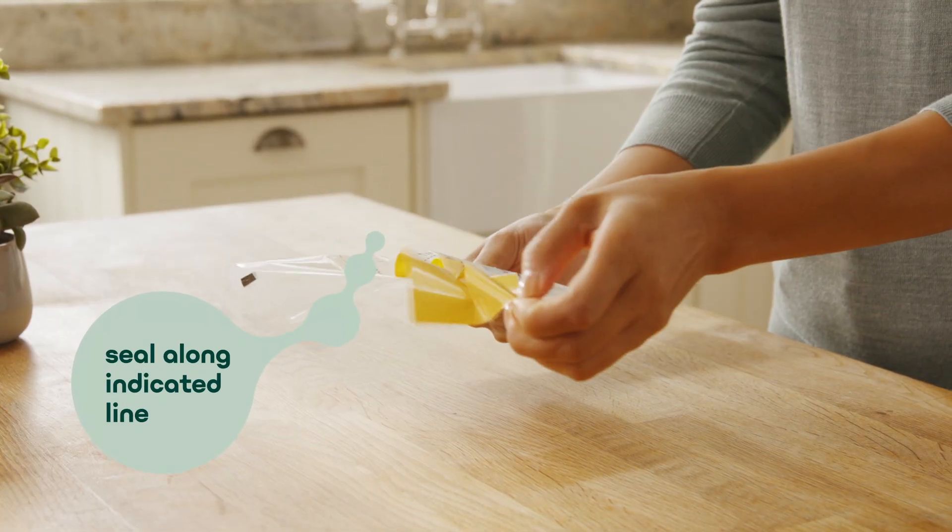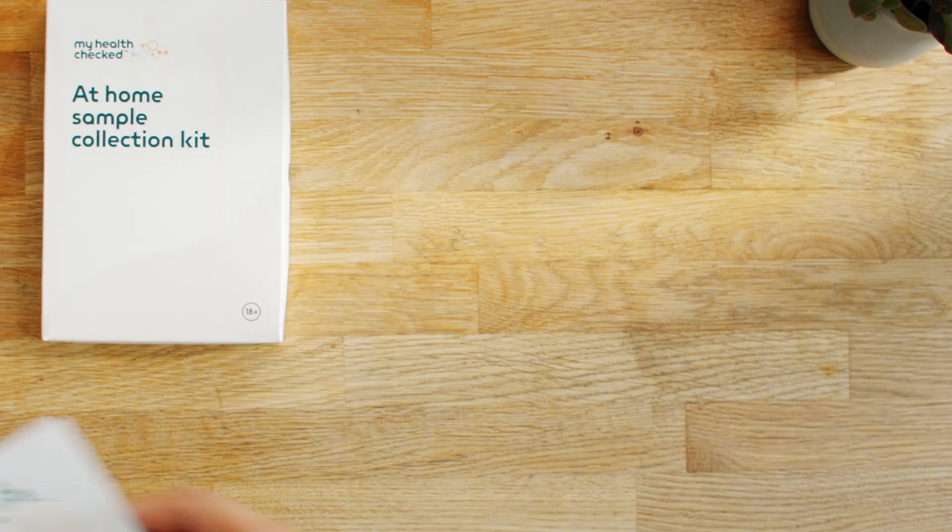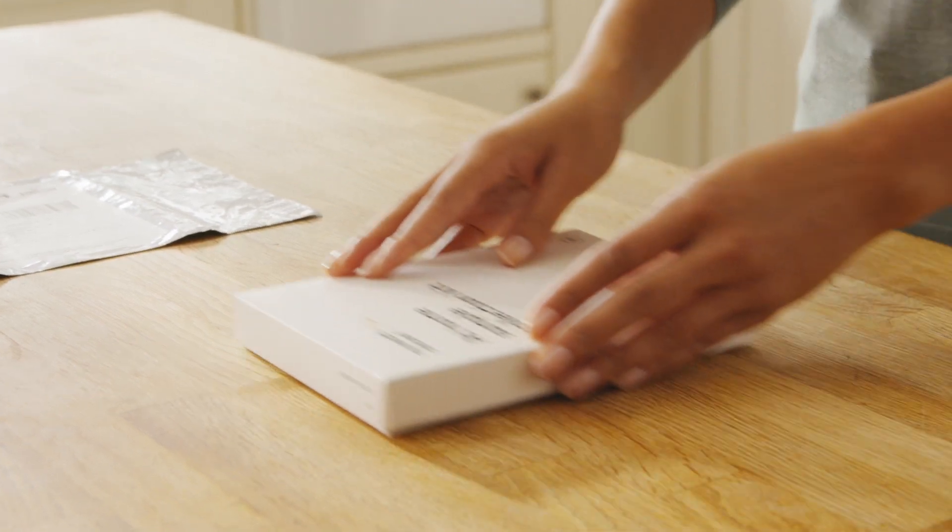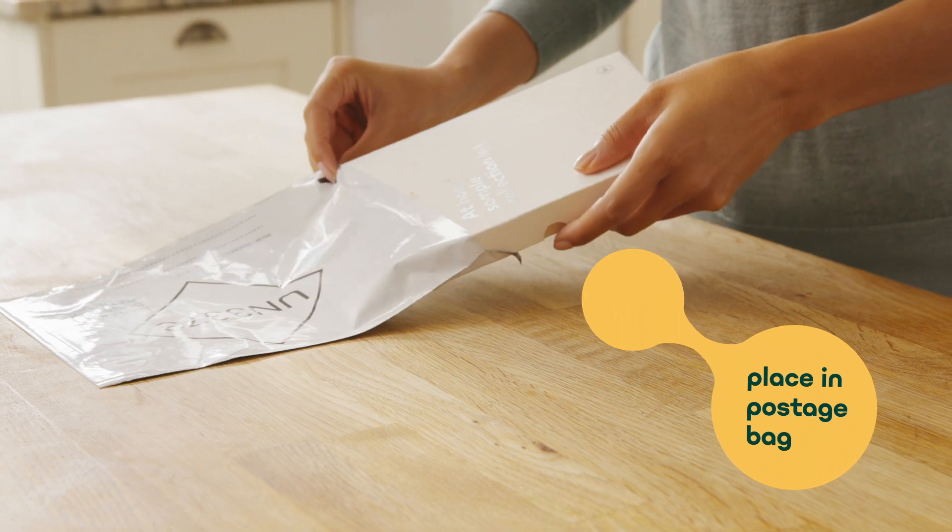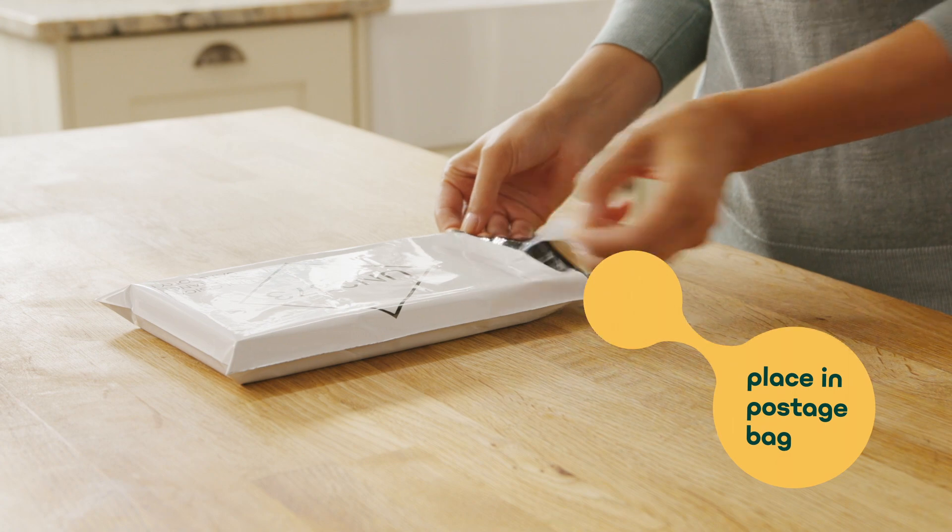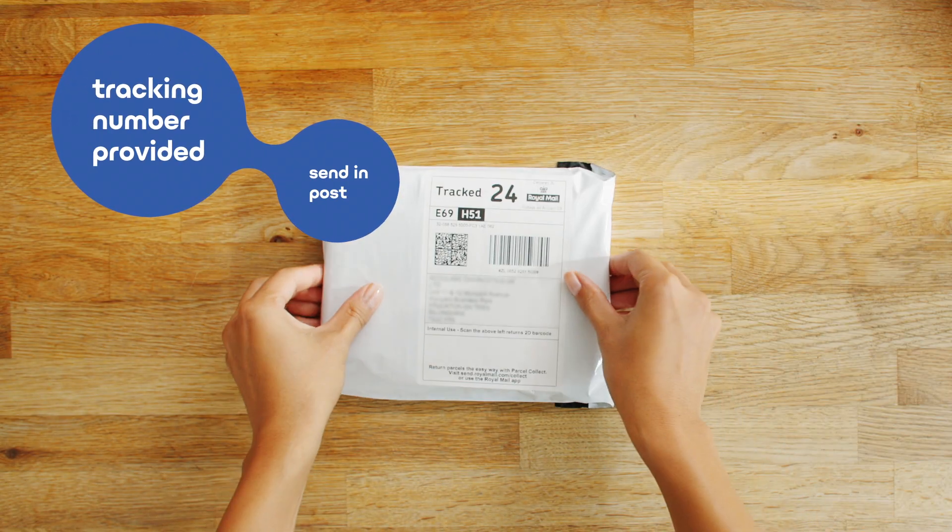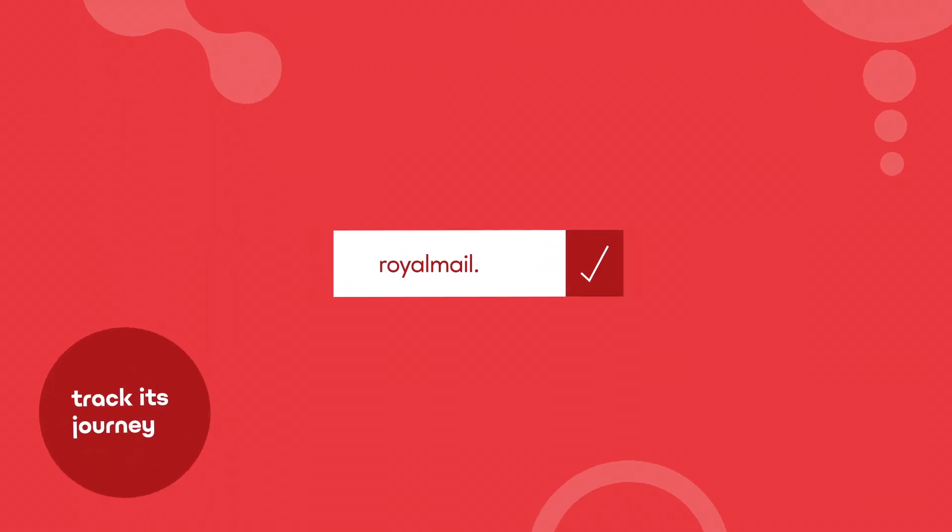Remove the adhesive strip. Fold the flap down and seal up to the indicated line. Keep your instruction leaflet to the side so you can make a note of your tracking number later. Put the transport bag containing your samples back into the original box, then place it inside the prepaid postage bag provided and return via any Royal Mail post box. To track your samples return to our lab, please make a note of the tracking number on your leaflet so you can track its journey on the Royal Mail website.